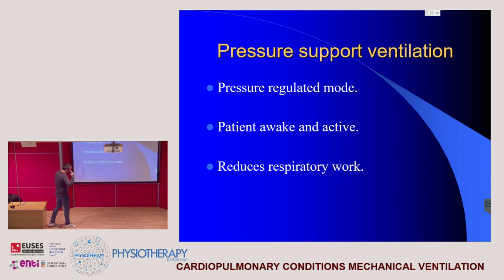As I said previously, the objective is to extubate the patients, to perform the weaning process to remove the tube, but we need the patient to be able to breathe on his own spontaneously.